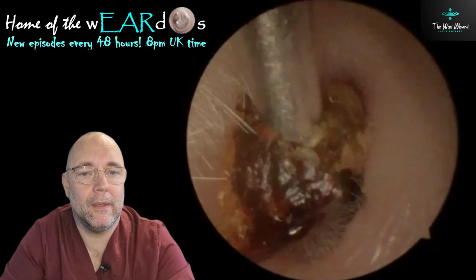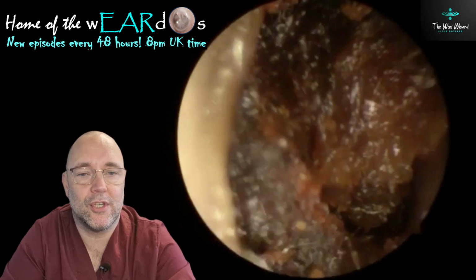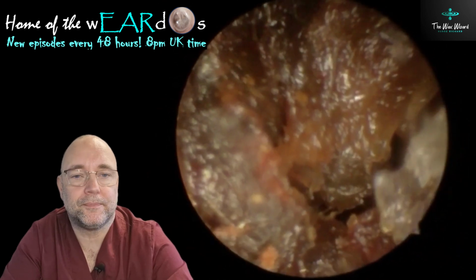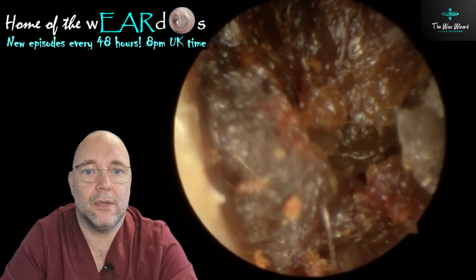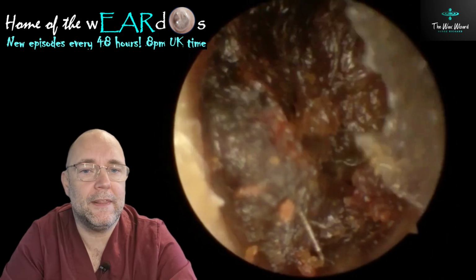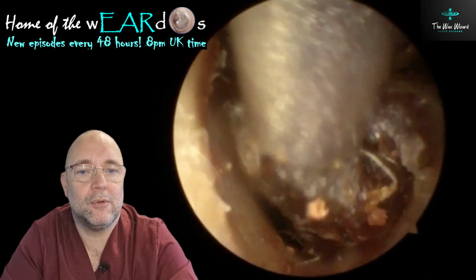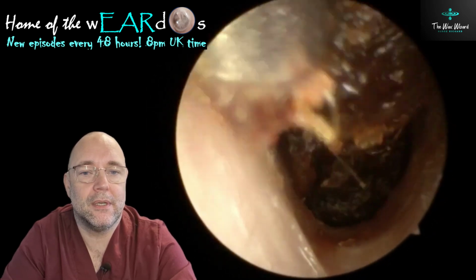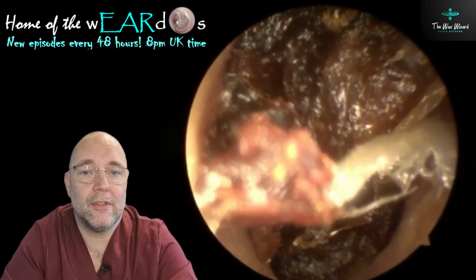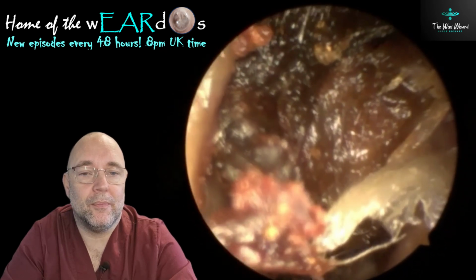Quite a narrow, tricky little area. There's a little bump on there on the way out. Not entirely sure what that is. I don't think it's anything of concern, just a little polyp or something. A little skin growth. Always worth getting these things checked out though, but I really don't think it's anything of any concern at all. Again, this bit was very dark as well. Extremely dark and a bit crumbly, so it didn't stay together, so it came out in instalments rather than in one big one. We're almost there with this.